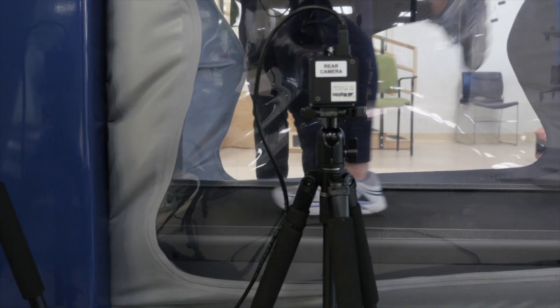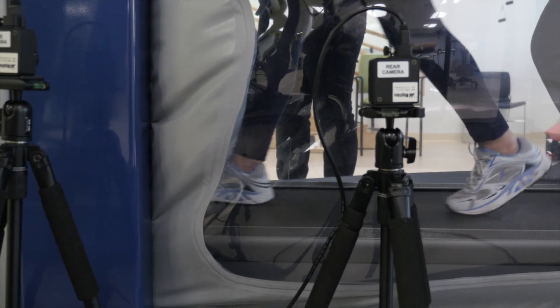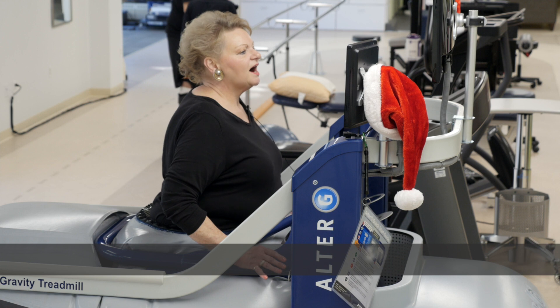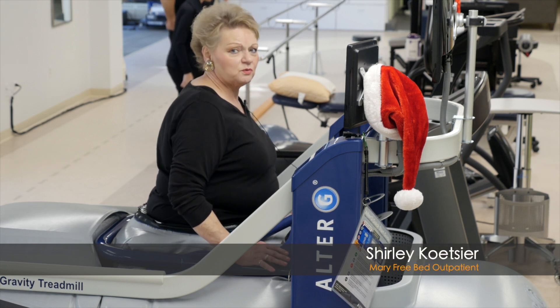It does help you to concentrate on your walking a little bit, so you're not worrying about having pain. Plus being able to walk at a faster rate — it feels like all the parts are working together.